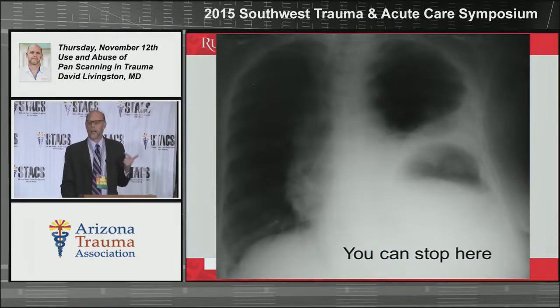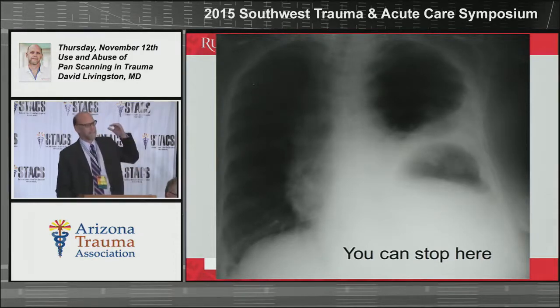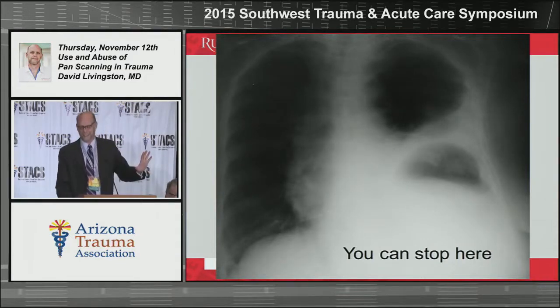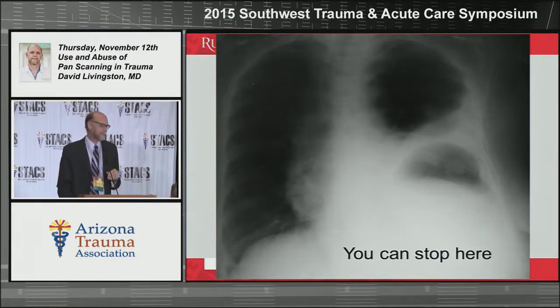Now, you can stop here, right? This is a ruptured left hemidiaphragm. Your stomach should not be in your chest. You don't need anything more. I know some of my junior partners would be getting some more films because they got to see a lot of stuff. But again, I am old and ornery, and my compassion fatigue meter is way out there. It's like, sir, you need an operation. I'll fix it, and I'll figure out whatever else is in there when I get there, all right?